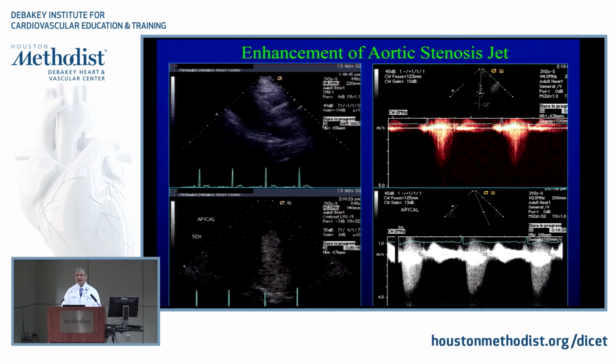And I know Eleonora and previously Dr. Margianis was working on this. But we know that if you enhance these, I can tell you from our experience in TR, tricuspid regurgitation jet, if you do it very early, you will bloom this, and it may be even half a meter per second. So you got to be very careful of when you do that.